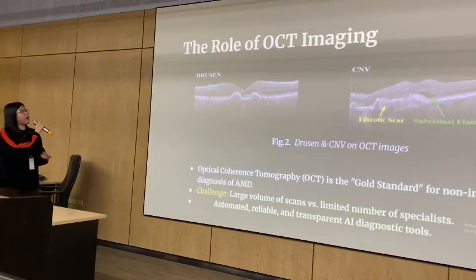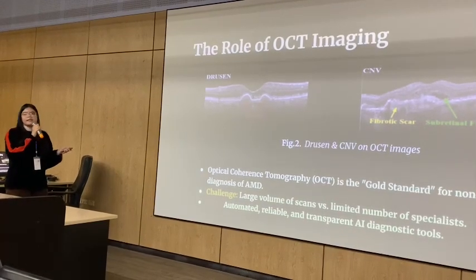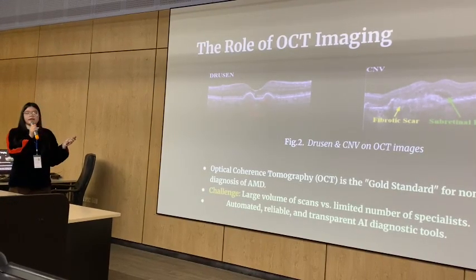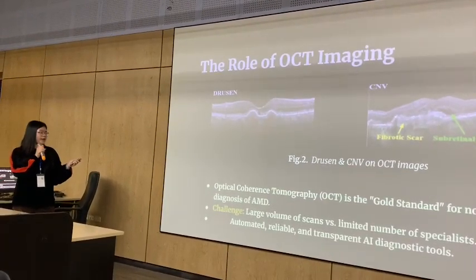The next thing is about the role of OCT imaging. So what does OCT stand for? OCT is optical coherence tomography, and this is considered the gold standard for non-invasive diagnosis of AMD.